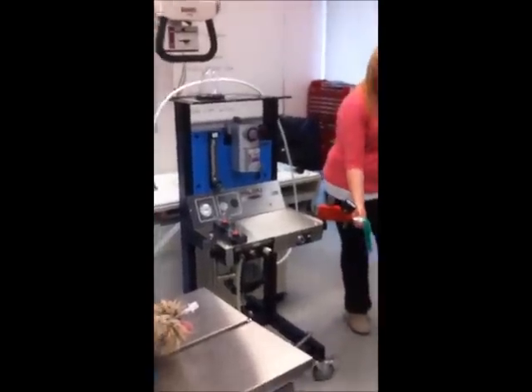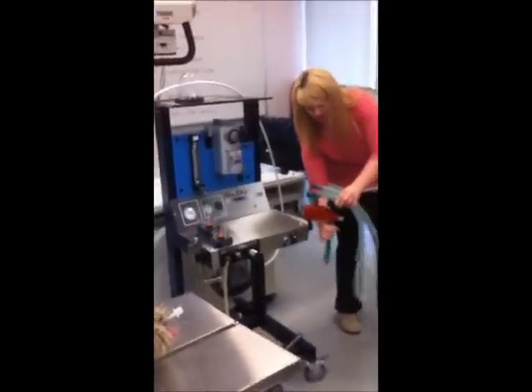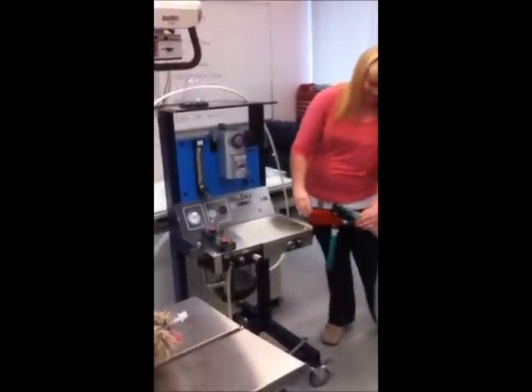Windows on this side? No, under. Bottom. There you go. Just pretend you need to help them breathe. It's easier to squeeze it down there. Oh, yeah, sure thing.